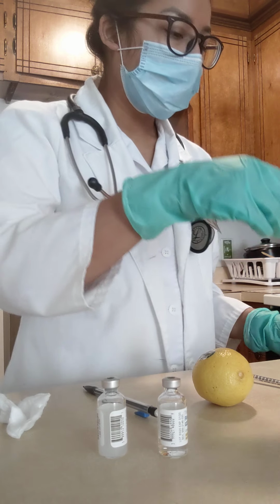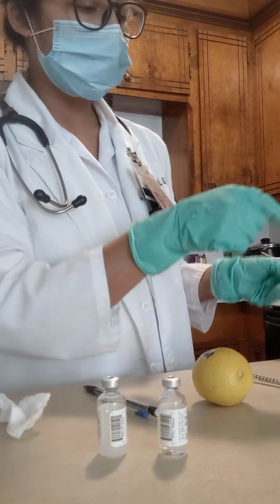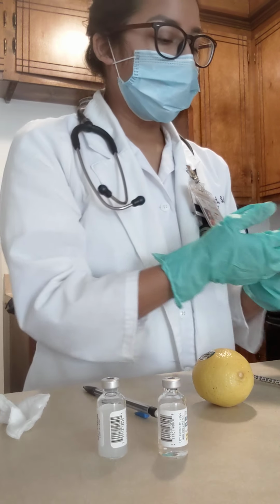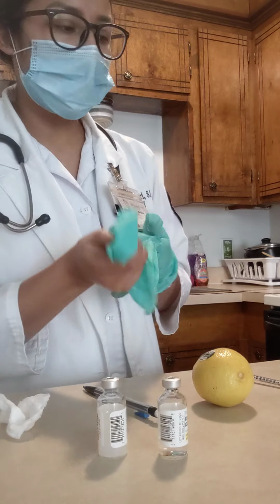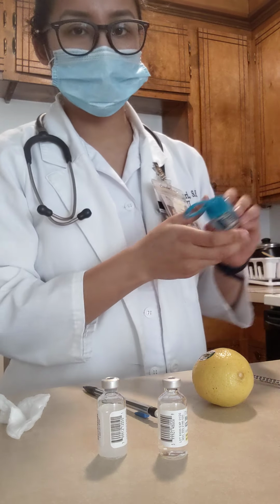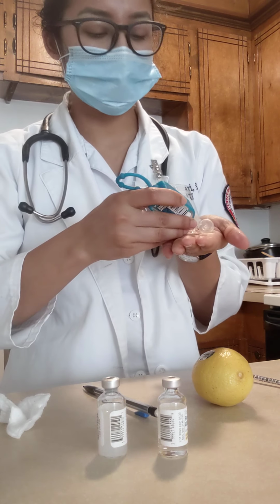Now I will turn off my meter and disinfect my meter. I'll remove my gloves, do hand hygiene, and I'll tell my patient that his blood glucose level was 252 mg per dL, and I will document the procedure.